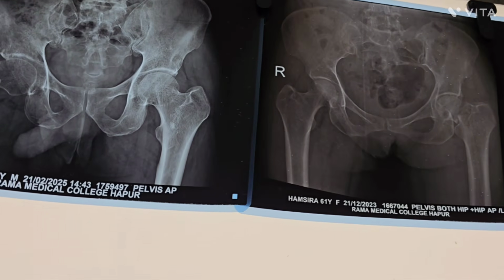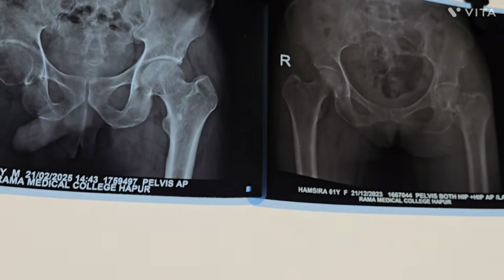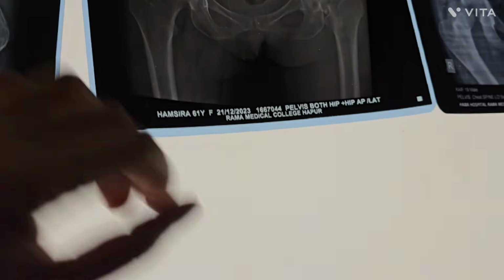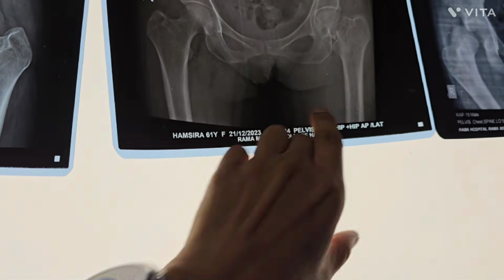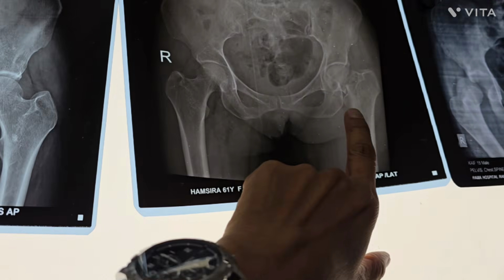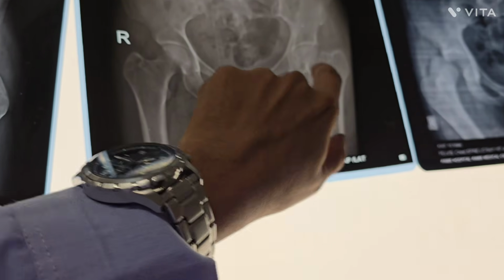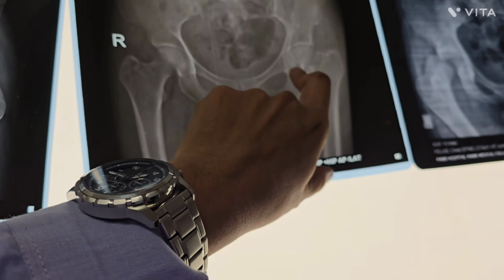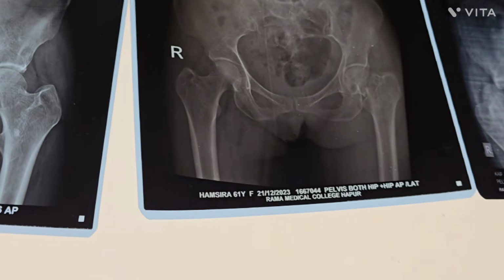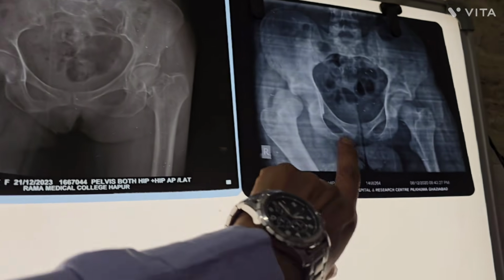If the patient is around 50 or so, this is the neck of femur fracture. In this case, if the patient is young, like 30 to 40 years of age, primarily you can do CCS fixation with 3 screws like this. If the CCS screw fails or the acetabulum is arthritic, then you can do total hip arthroplasty or THR.